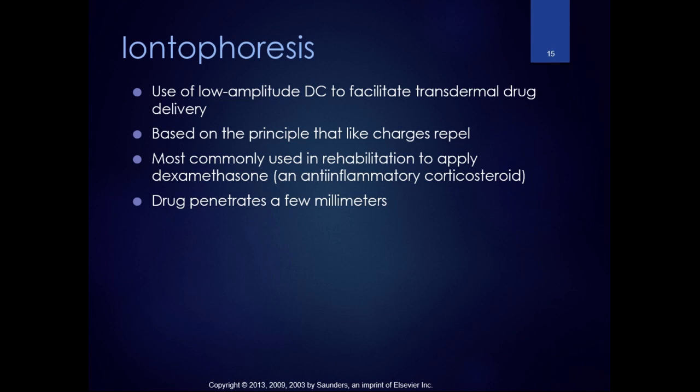And the drug penetrates a few millimeters. So where I've used it the most in the clinic where I am, I work with a foot and ankle specialist as one of our PTs, and he uses it a lot with chronic ankle conditions. So that's just one. Plantar fasciitis is another one that I've used it with.